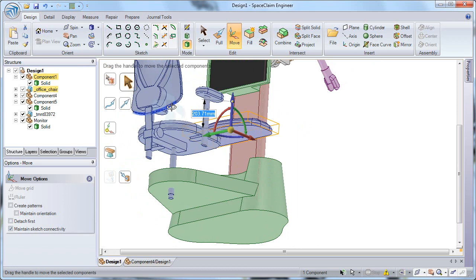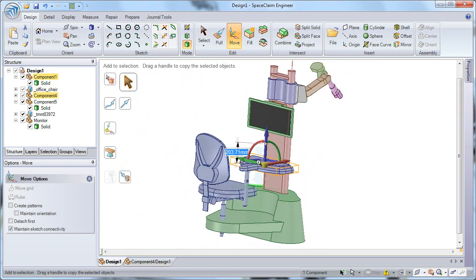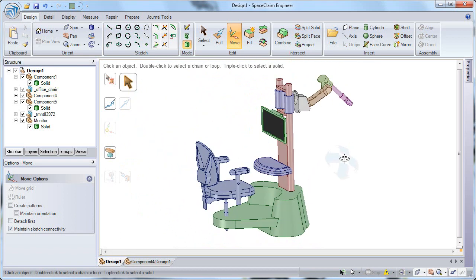And so you can see our final assembly for our medical cart assembly that we've created using conceptual design tools in SpaceClaim.